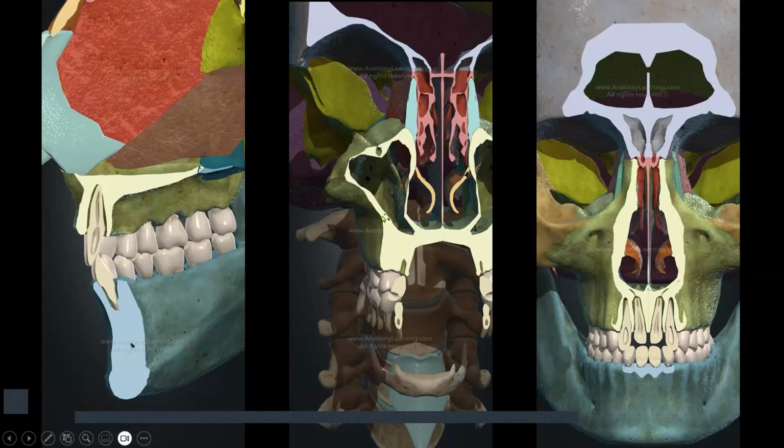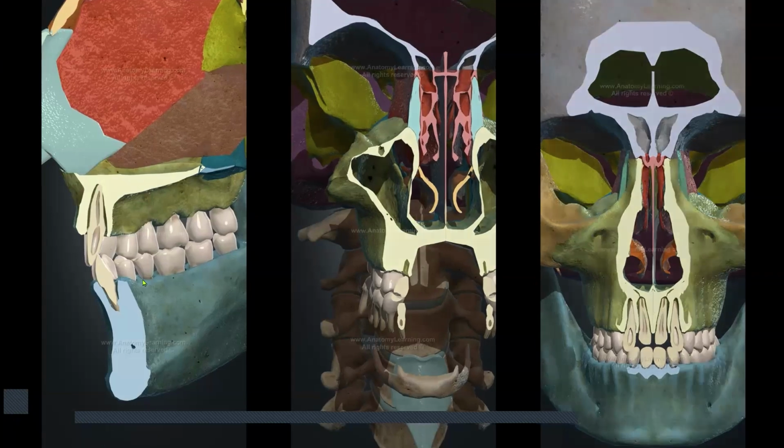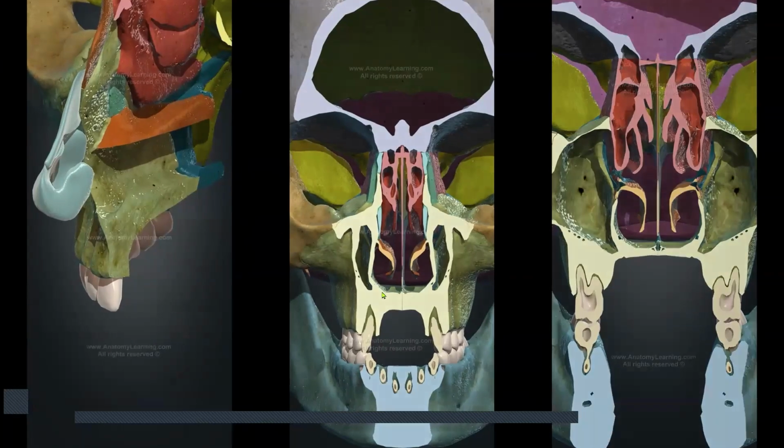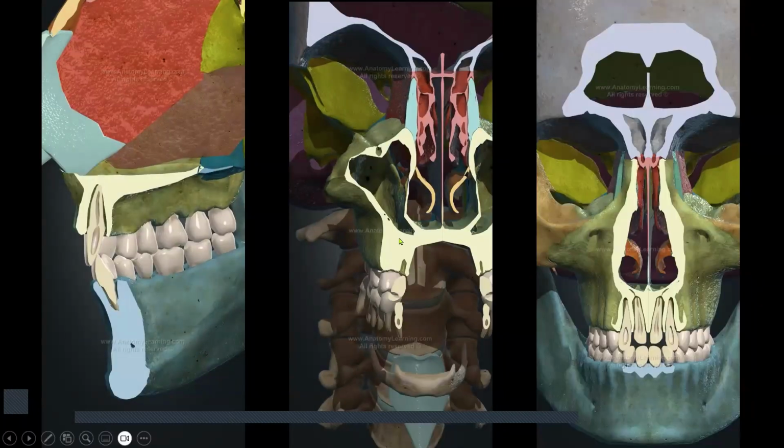Again, in the premolar region, now this sinus is more pneumatized than earlier. What I showed you in the last slide was that there was too much space and it was easy to approach the nasal floor. But here in this slide, if you see, this space is very little. So if you want to engage the nasal floor, you have to maintain your angulation to enter into the nasal floor. Even if this sinus is more pneumatized than this, then you may have to go transsinus to engage the nasal floor.